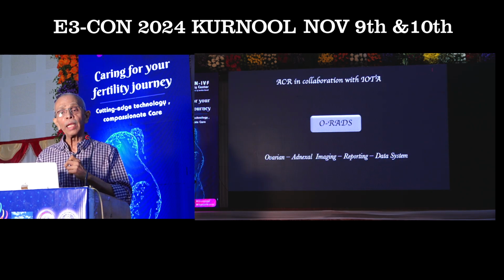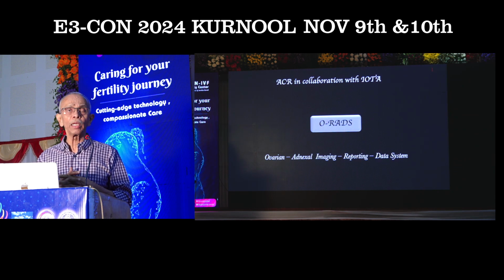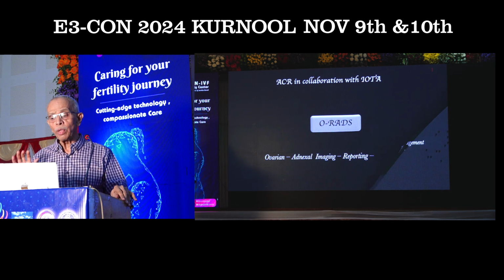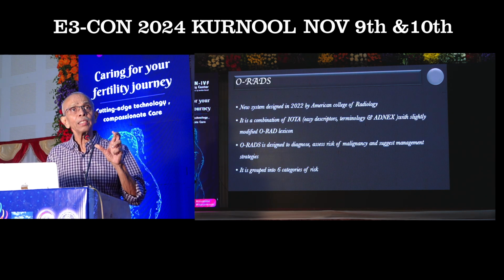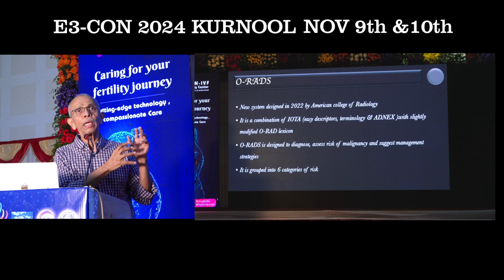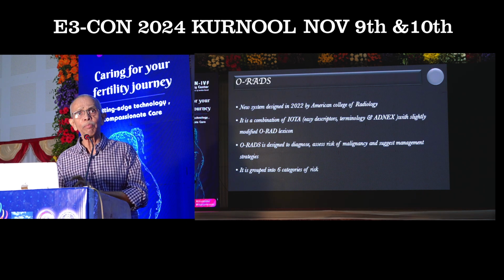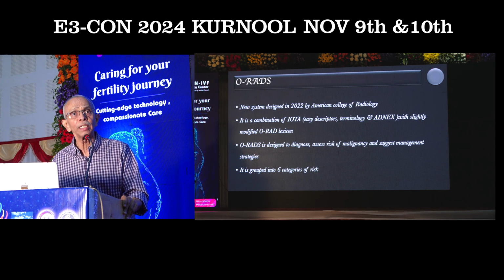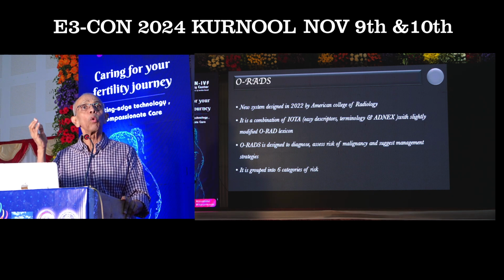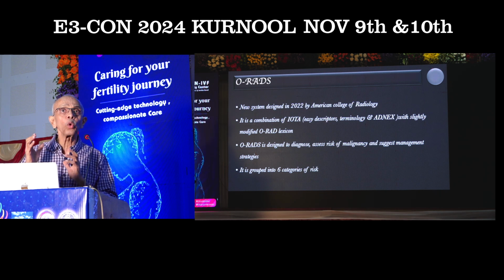Now then comes the O-RADS. O-RADS is the one which has been formed in collaboration with the American College of Radiology. O-RADS is the Ovarian-Adnexal Imaging Reporting and Data System, in which they have used various categories. By using O-RADS, they have amalgamated the IOTA terminology as well as the simple descriptors and the simple rules. They have added certain descriptions such as hydrosalpinx and para-ovarian cyst into their lexicon. This is what is called the O-RADS lexicon. Putting all those things into consideration, they have given a risk score for malignancy.